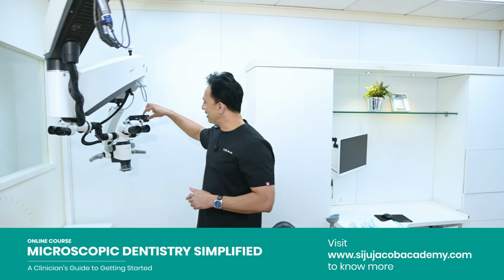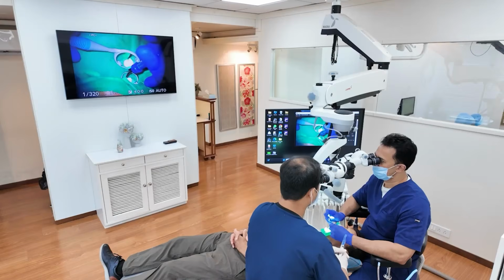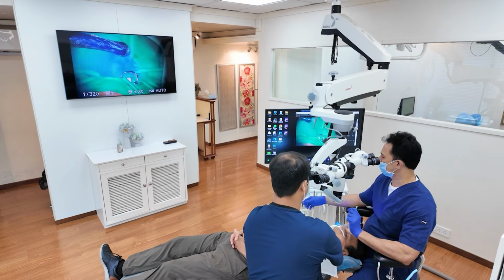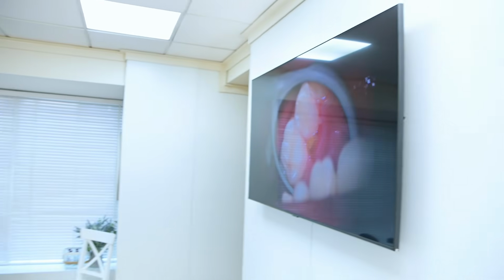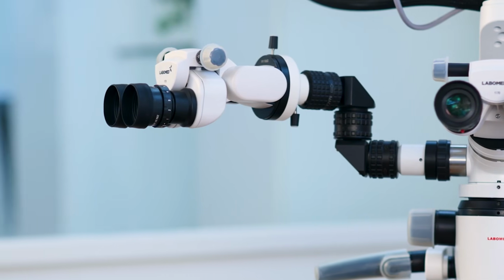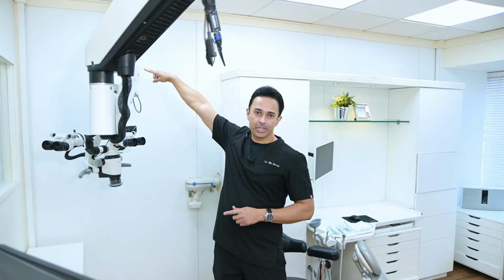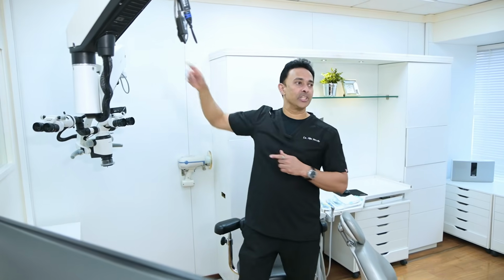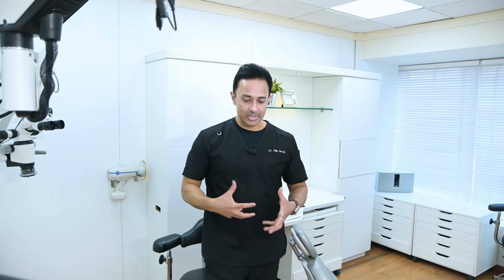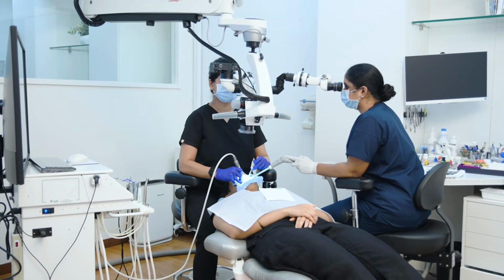And if you see, there's a camera here and there are these attachments through which you can have live HDMI output on the screen for the patient's assistant to watch. You can check your clinical pictures on the screen. So you can have as many screens as you want. We have just one because we have an assistant scope on the scope, so the assistant can actually see through this. Some operators prefer to have a monitor for the assistant, so you'll find extra monitors on that side so the assistant can watch through the monitor, but we prefer an assistant scope because that's much more involved for the assistant because they can see things in real time. As far as the depth of field is concerned, it's much easier when you have an assistant scope rather than a monitor.